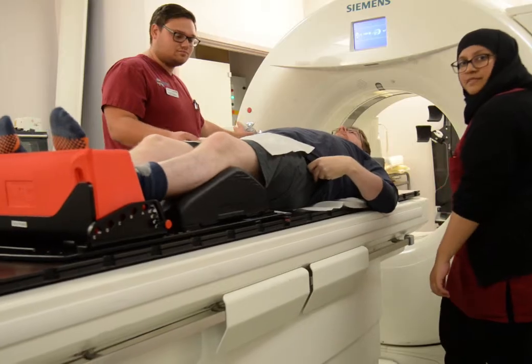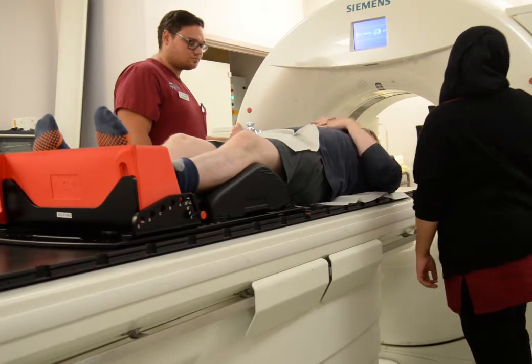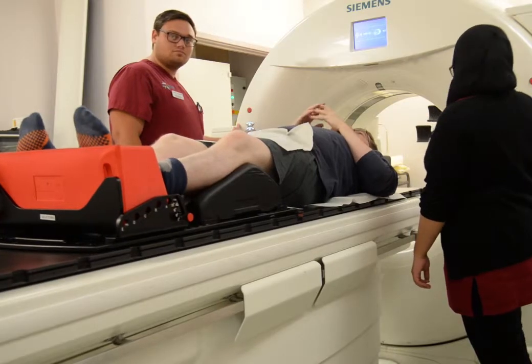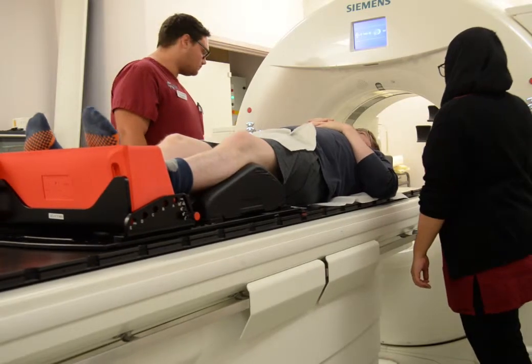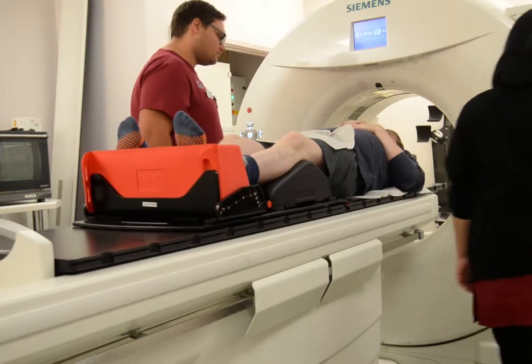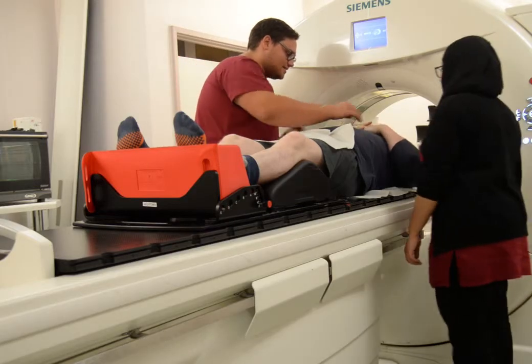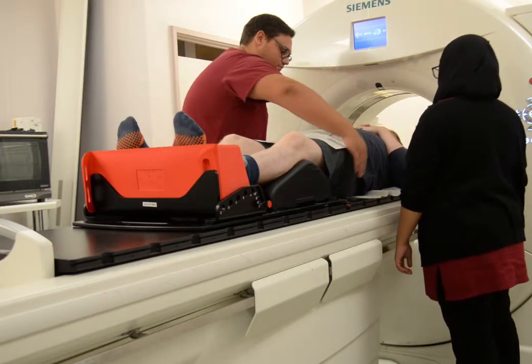When you are lying on the bed, the radiographers will be talking over you, calling out different information and taking lots of measurements. They will draw some marks on your skin with a pen, and they will put some small markers onto your skin with tape. These markers show up on the CT scan. Please do not talk to them while they're doing this. There will be time for questions later.